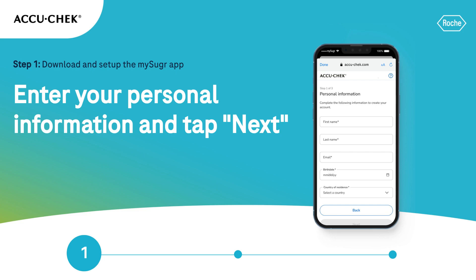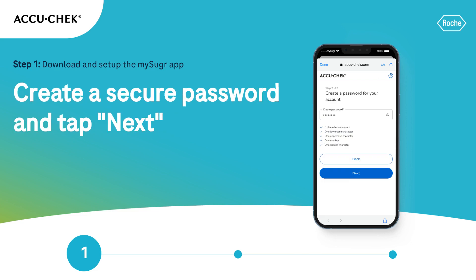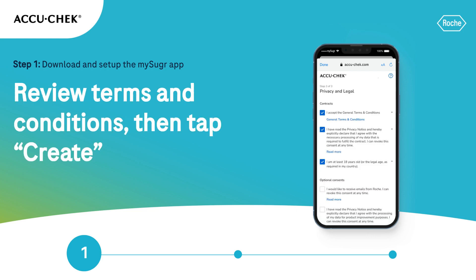Enter your personal information and then tap Next. Create a secure password and tap Next. Review the terms and conditions and provide consent for any mandatory features, then tap Create.